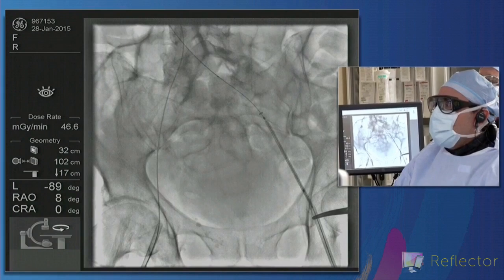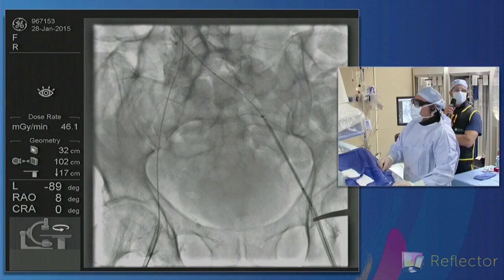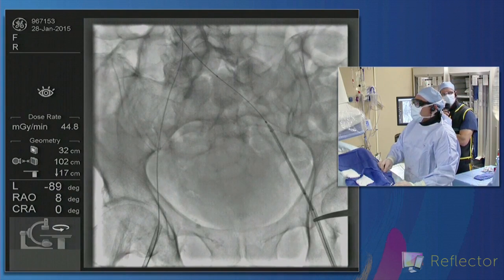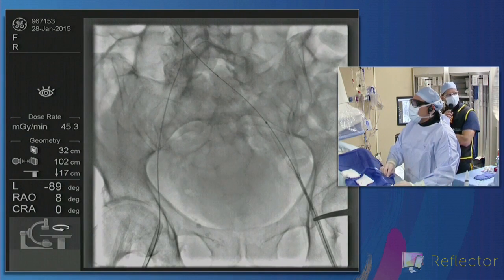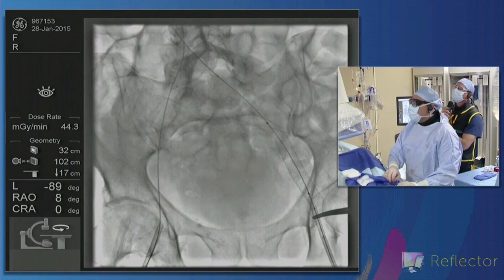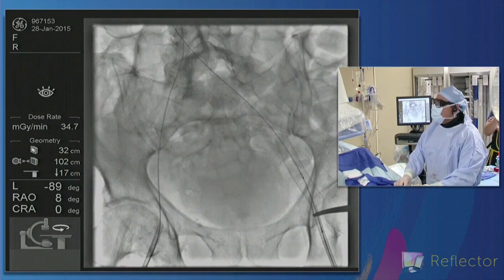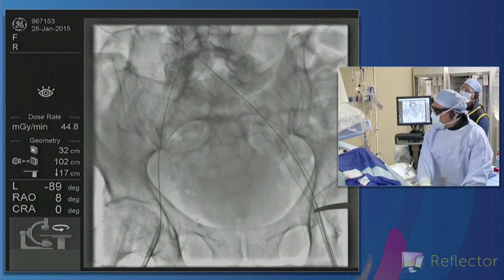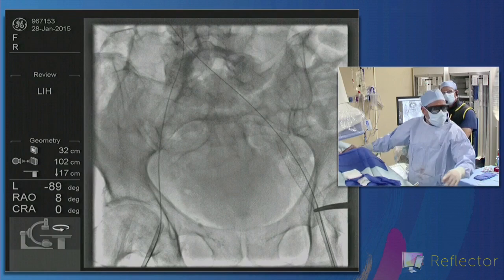So what's now the pullback etiology of this one? That's interesting. On the IVUS, there was an artery near it, not immediately at the level of greatest compression, but above and below, this artery did seem to be against it, and you could almost see some pulsatility in the vein. Particularly as people get older, we know that they get ectasia in the iliac vessels, and I think that contributes to it. That, combined with maybe some underlying atherosclerosis and chronic fibrotic and inflammatory changes. So we don't know for sure, but clearly on IVUS there was proximity of the artery to the vein in this case.